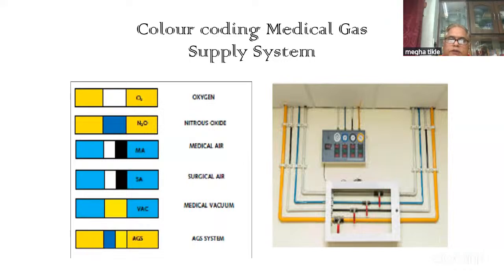On the other photo, you see the pipeline coming inside the operation theater, and each gas has its own pressure indicator. So the pipeline pressure is already indicated, and every time before entering the operation theater, it is generally mandatory that somebody checks the pressure in the pipeline, because the pressure itself decides many of the safety features in the anesthesia machine. If there is a crossover or some change in the pressure, most of the systems may not function appropriately in the anesthesia machine.